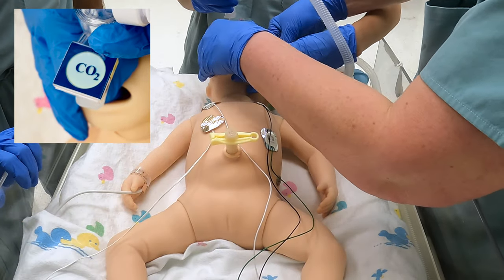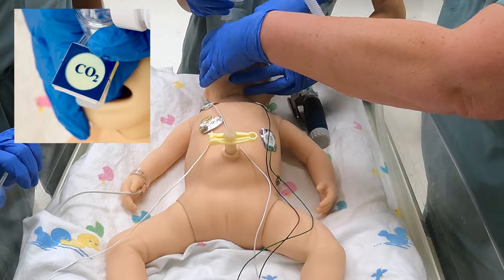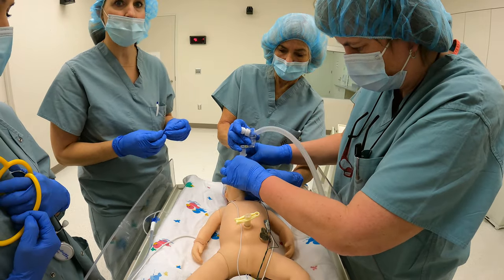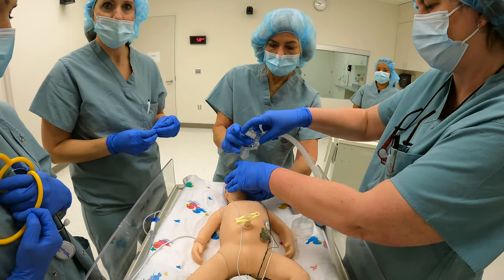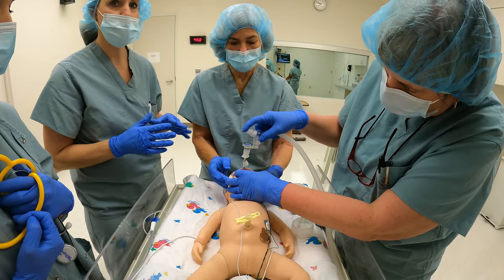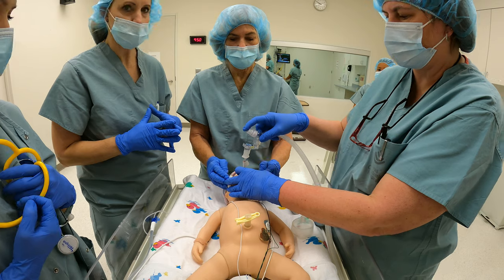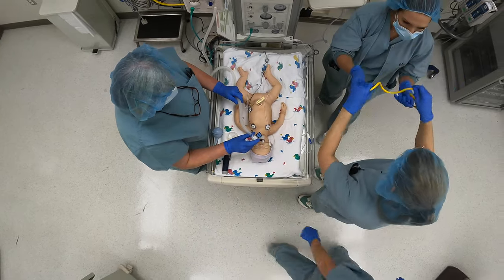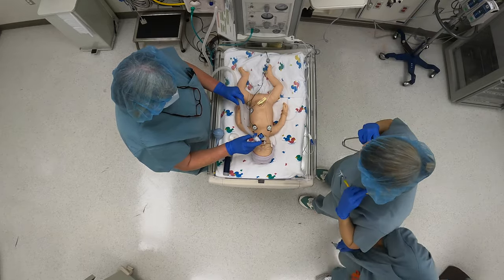Okay, team, to recap, we are intubated. The heart rate has increased some. We need to give 30 seconds of effective ventilation through our alternative airway and see how the heart rate responds. I have the ET tube taped at 8.5. Okay, meanwhile, let's get ready for compressions to start in the event that the heart rate does not improve further.